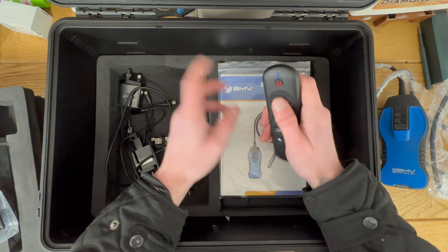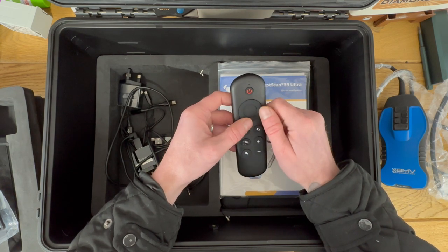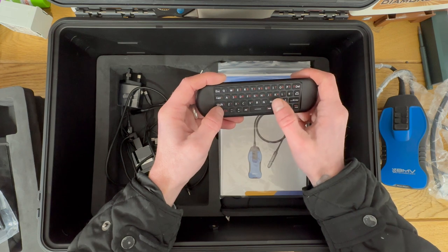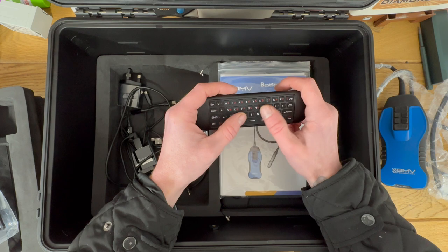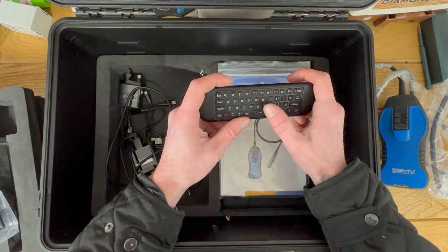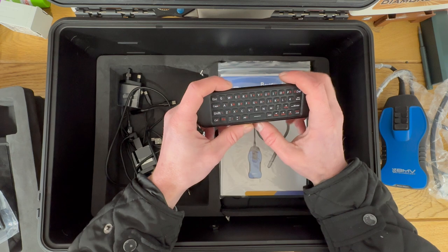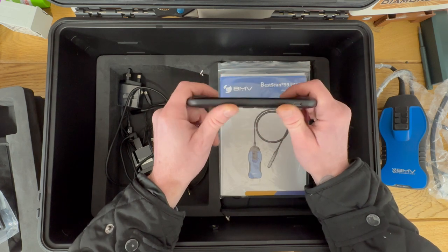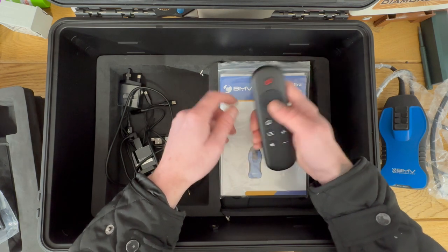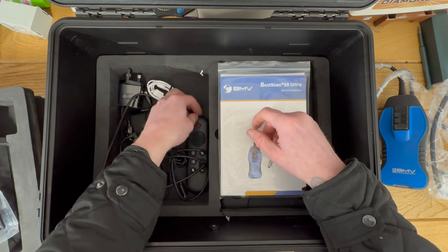You can use the cursor button to control options within the device, or just use the up and down to control depth and gain. They've also added a keyboard on there, I think in hopes that if you want to complete the diagnostic information within the goggles for the cattle you're scanning you can use that function. Personally I'm not great at using these little keyboards, but it is an option — you might find yourself using it when you first get the tablet and then stick with it.